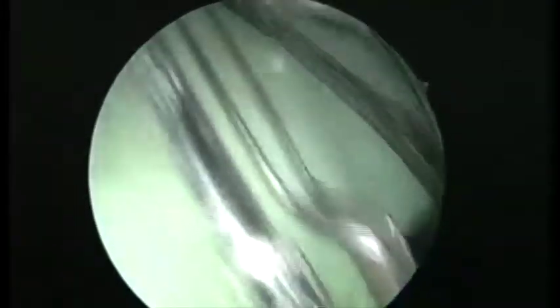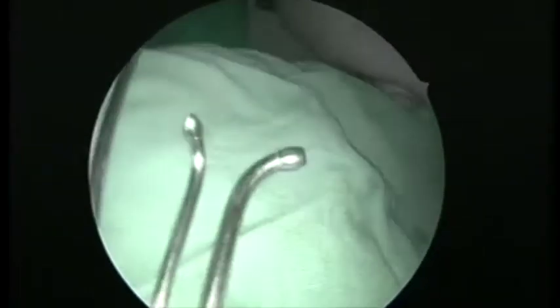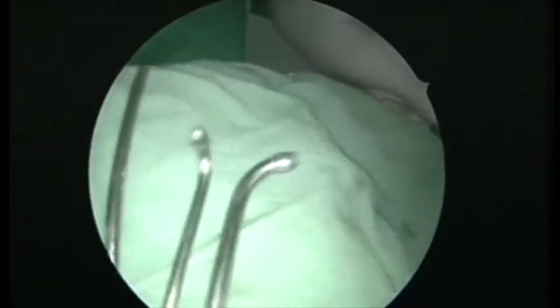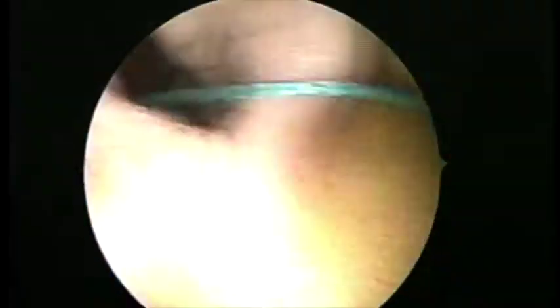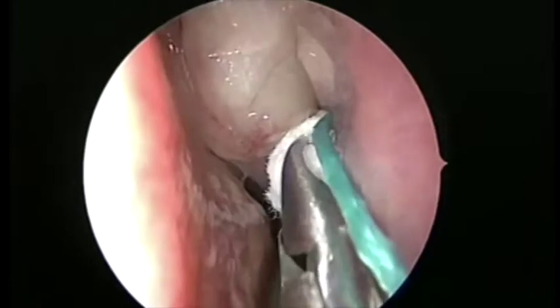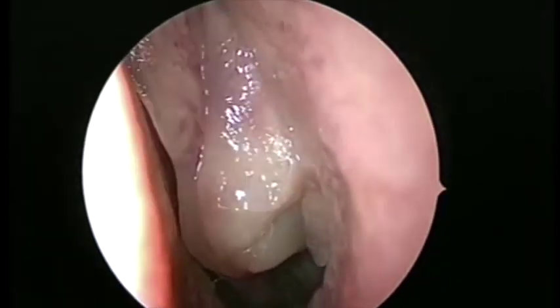This is a dental syringe that I use for infiltration. Among the suctions, we have a short-curve suction. I am now going to remove the patties I placed inside. Minimal communication in the operating room, please. You can see that beautiful decongestion - I must congratulate the anesthesiologist and Dr. Madhu for preparing the nasal cavity.